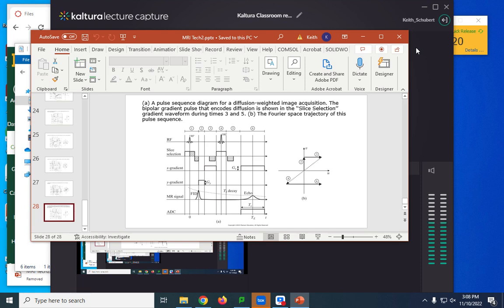So this is also why we typically do resolutions like 512 by 512, because FFT is always more efficient for powers of 2. That's why our pixel counts are always going to be powers of 2, like 512, which is 2 to the 9. The next step up would be 2 to the 10, so you'd be over 1,000. Usually that's going to be so much slower.